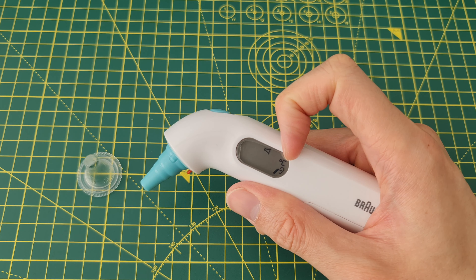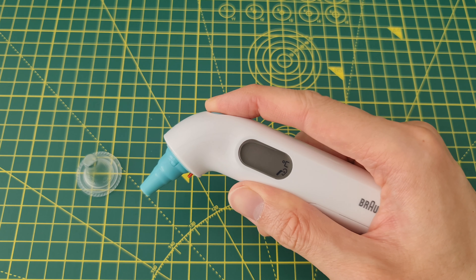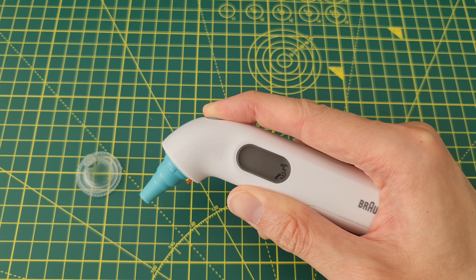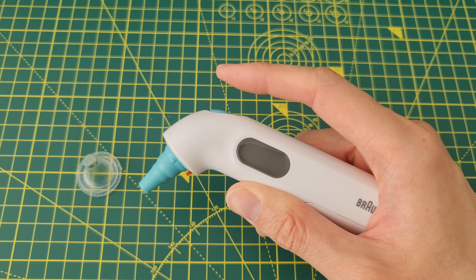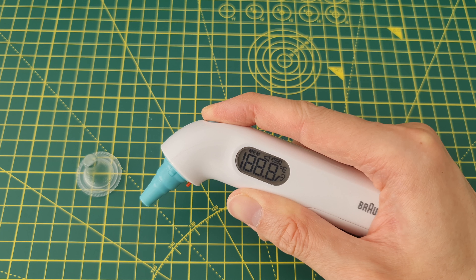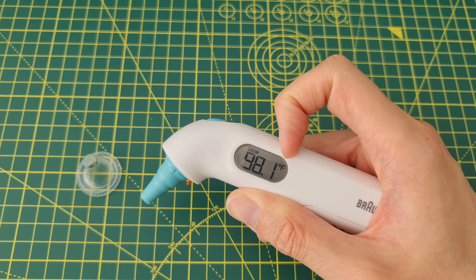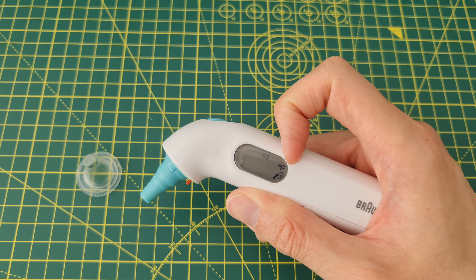It's set to Celsius and it's indicated on the display. If you select Fahrenheit it will show an 'F'. I'll do the same thing again to switch it to Fahrenheit — hold, let it cycle — Celsius, Fahrenheit — let go, it's set to Fahrenheit and there's an 'F' shown.